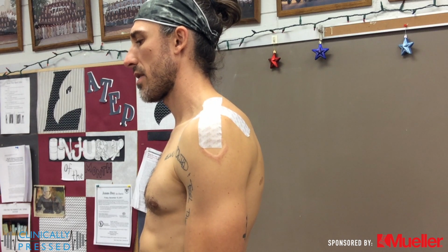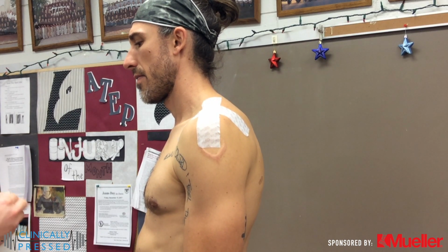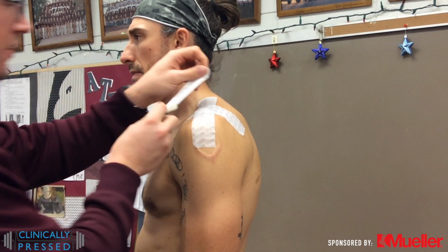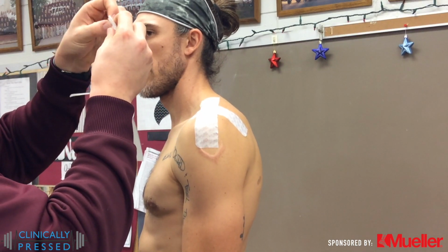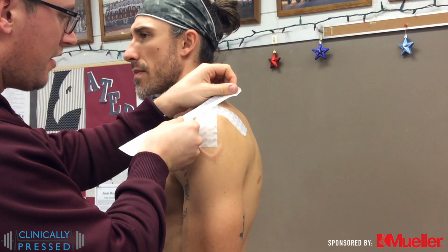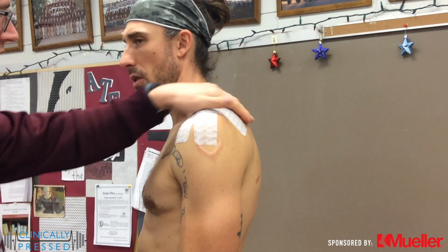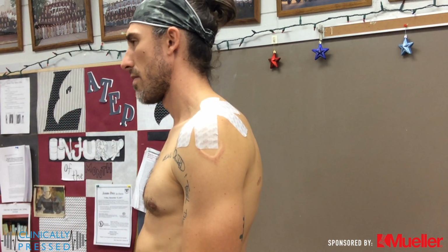the AC joint. With that, no real tension on this. You want them to lay flat. You could add a little tension over the AC joint just to make sure that they feel okay for this third strip, and you could potentially do a fourth strip. It's really up to you and what is working best for your patient and what seems to be getting you the best results in terms of controlling the motion of that clavicle.